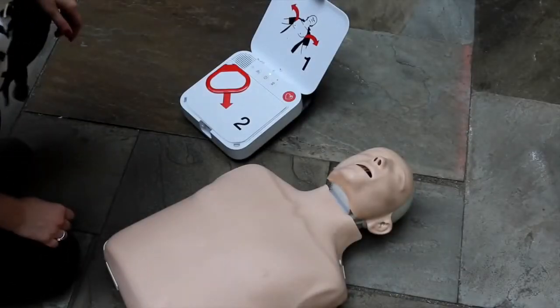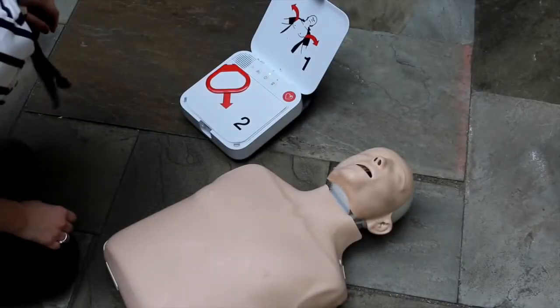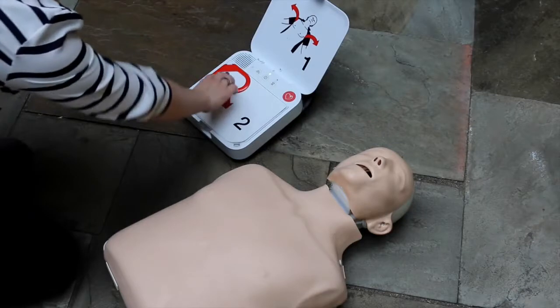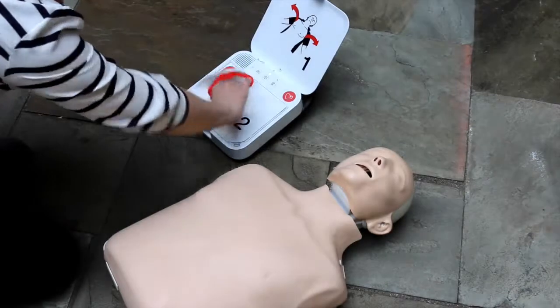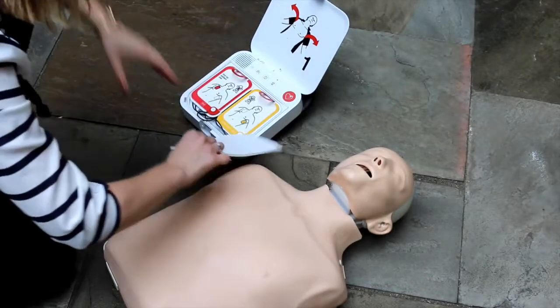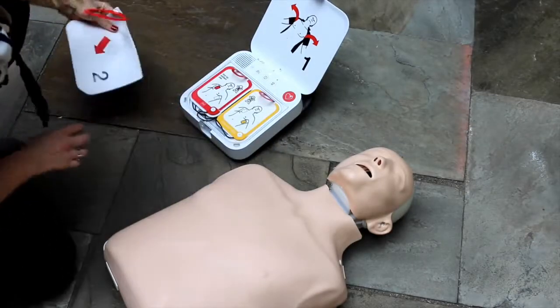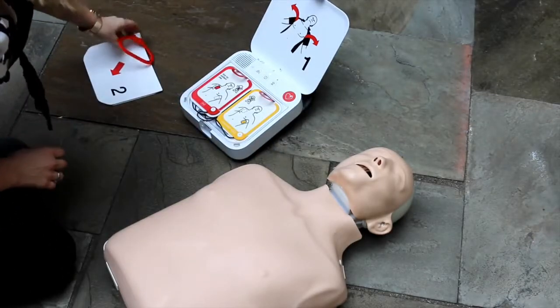Adult mode. Remove all clothing from patient's chest. Pour le français, appuyez sur le bouton de langue en haut à gauche.